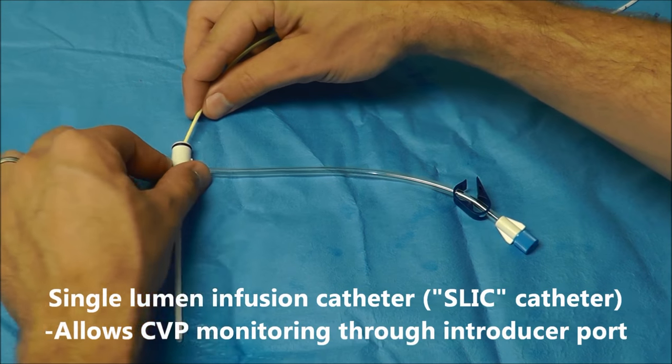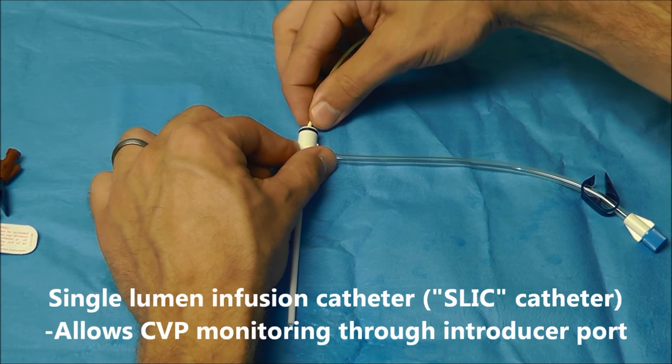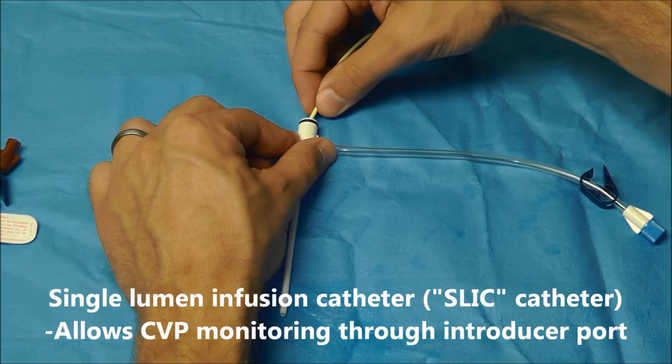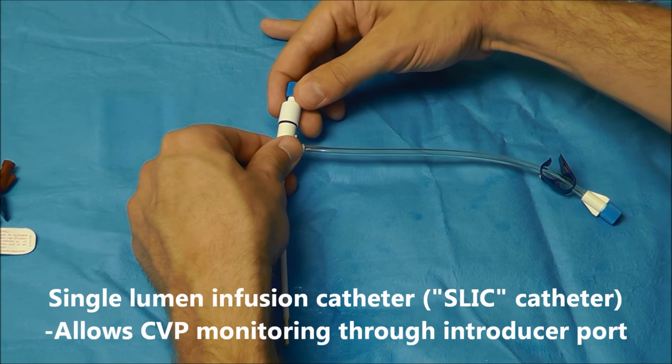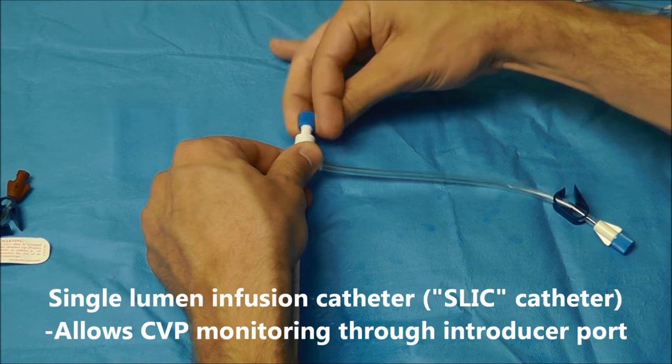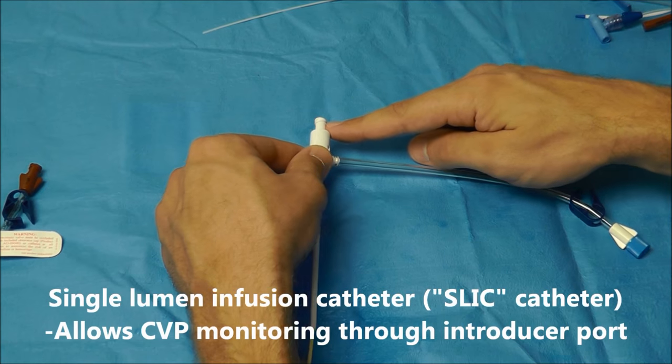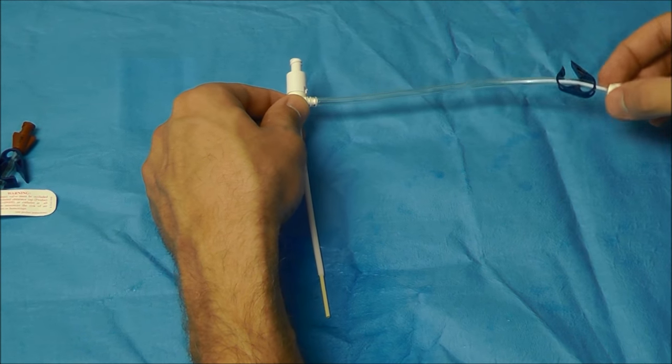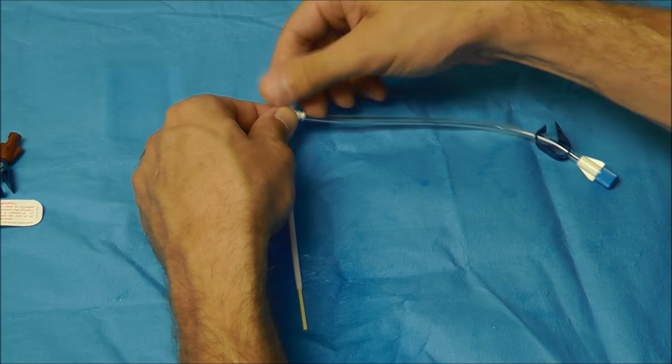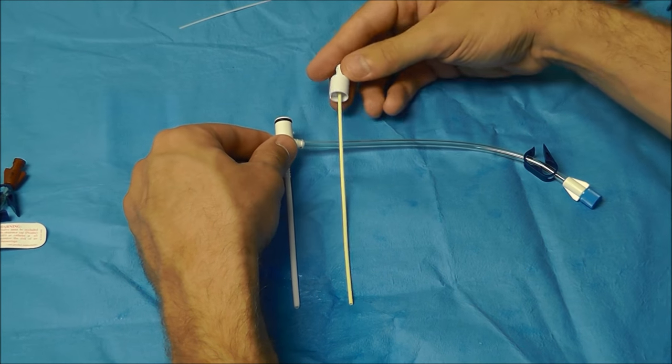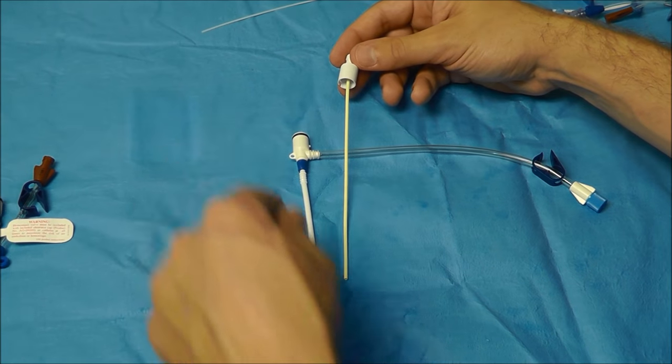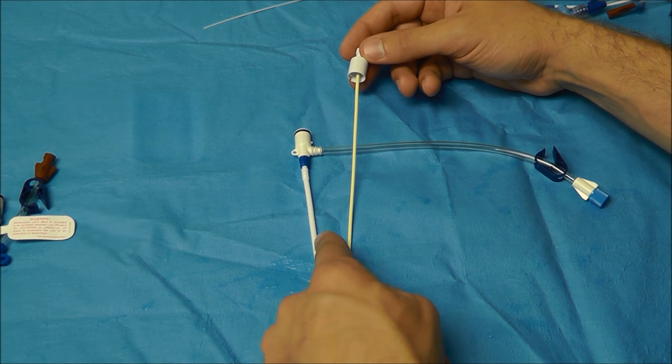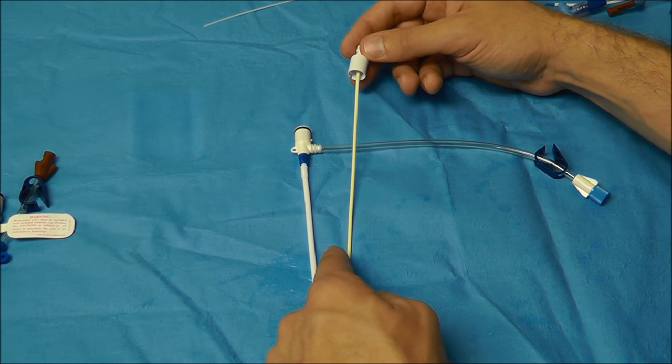What you do is you just insert this down the hub here of the introducer port, and once you get this on and connect it here, now this is going to allow you to hook up transducer tubing and monitor CVP on a single lumen cordis. So the only use of a slick catheter is if you want to monitor CVP on a central catheter that has an introducer port.